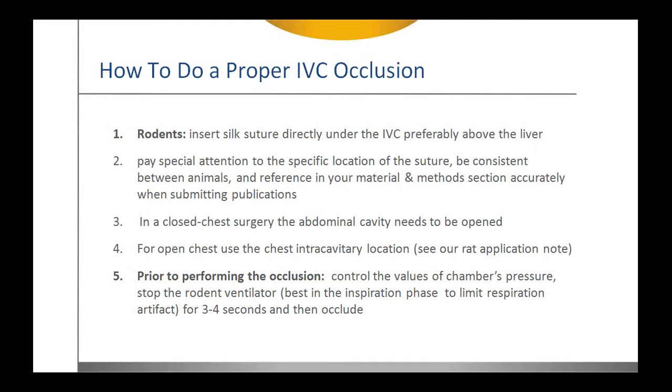And prior to performing the occlusion, control the values of chamber pressure. Stop the ventilator for a couple seconds, best in the inspiration phase to limit the respiration artifact, for 3 to 4 seconds, and then occlude.